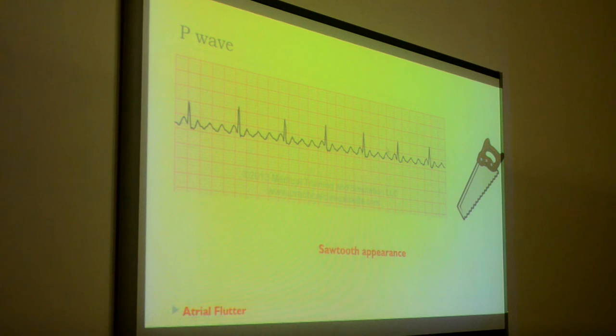This classic appearance. This is a sawtooth appearance. Yeah, a classic. They bring it in the exams. This is a classic sawtooth appearance. It looks like the teeth of a saw. Very fast. Look at this. It's like almost one square between them. Doctor? Yes. What's atrial flutter?